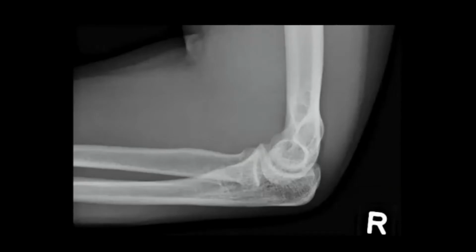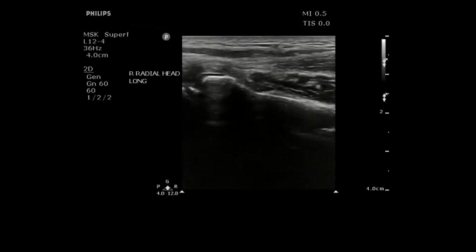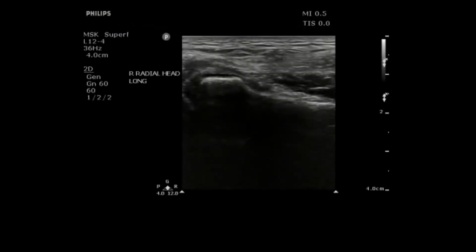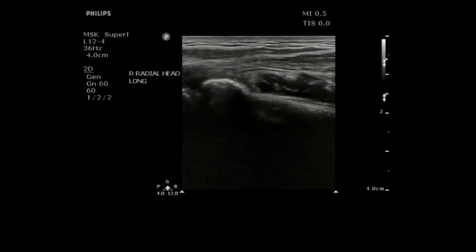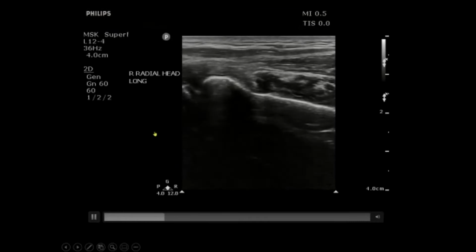And here's an example of a patient who has pain in the elbow, difficulty straightening out their arm. And you'll notice on the x-ray that, yeah, there's probably a little bit of a posterior fat pad there. And the x-ray was actually called normal. So we took a look with the ultrasound, and this is the radial head in the long axis view. And you can see that there's a little bit of cortical disruption right there. It's quite small.